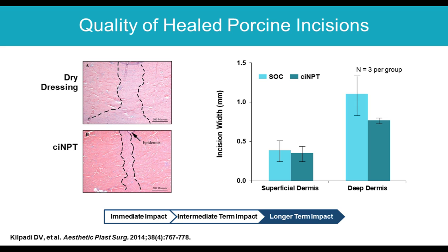And I'll conclude the basic science review looking at some histology, also from these same animals, that shows that underneath the negative pressure dressing, the zone of scar is much narrower than the zone of scar underneath plain dry dressings.